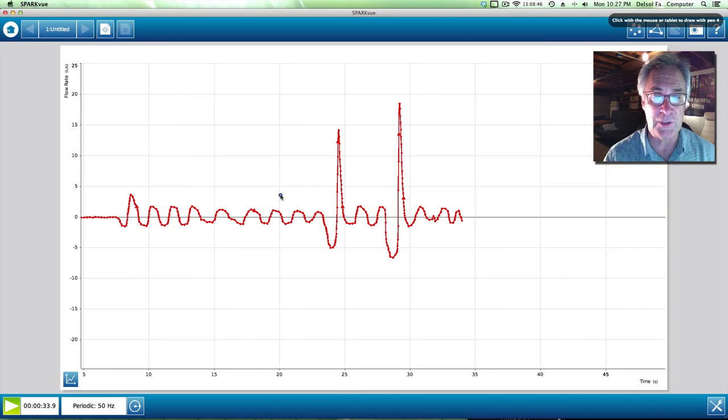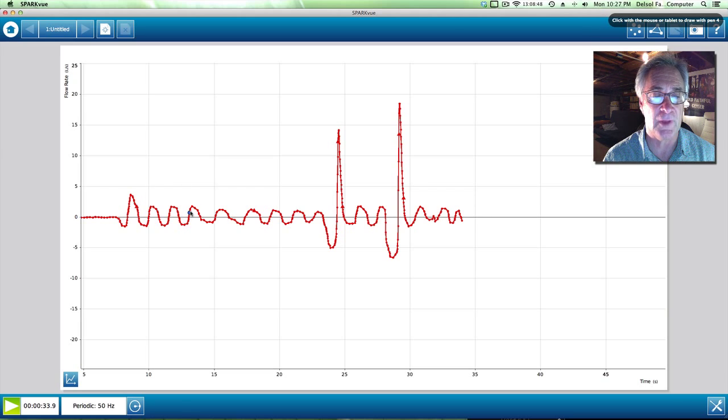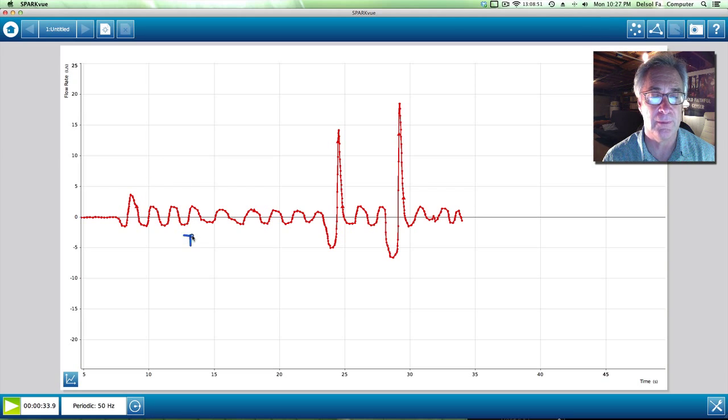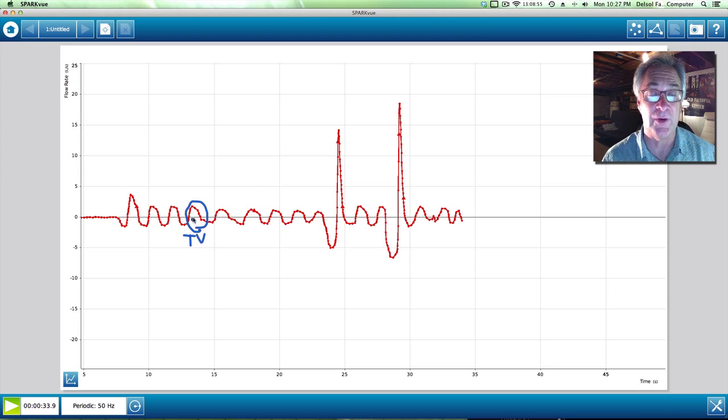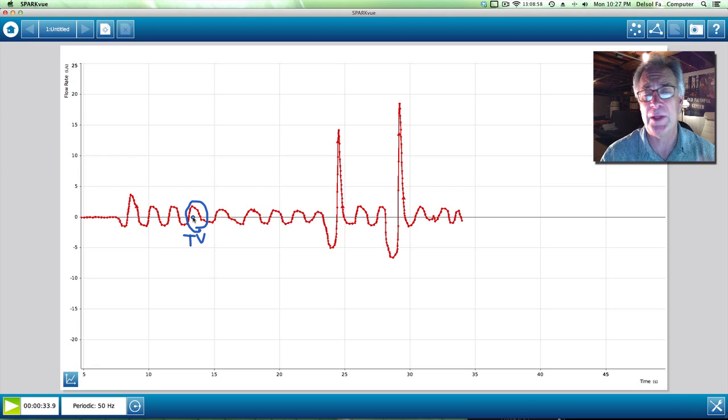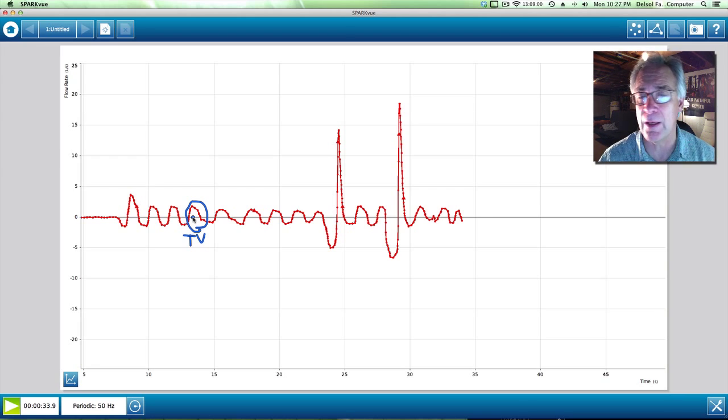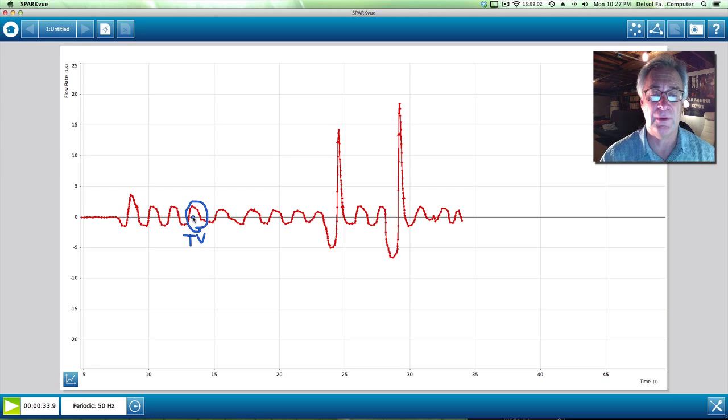So if we take a look at just one of these, this right here is referred to as tidal volume. That is basically how much air you're moving just in basically one breath very quietly. It's not forced at all.